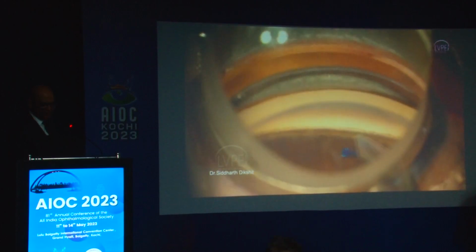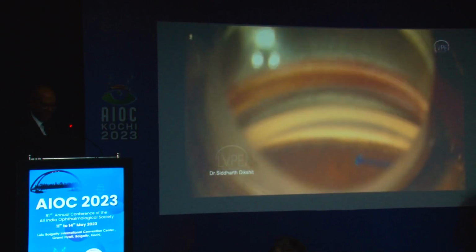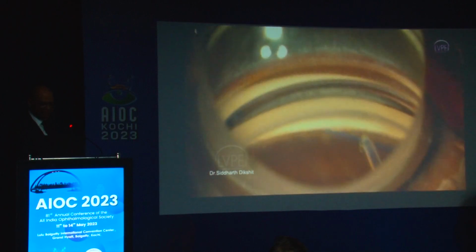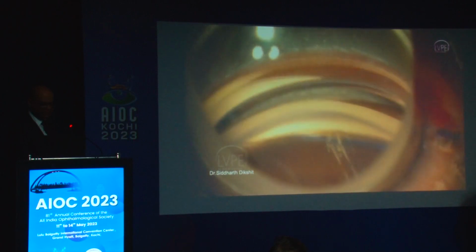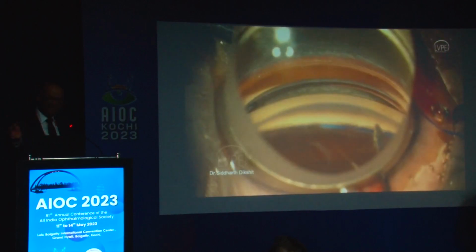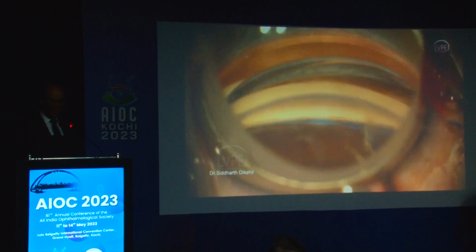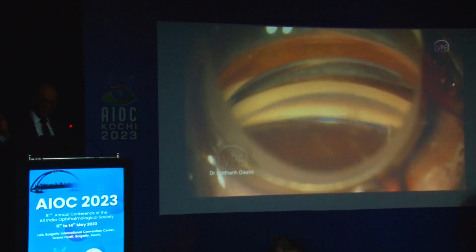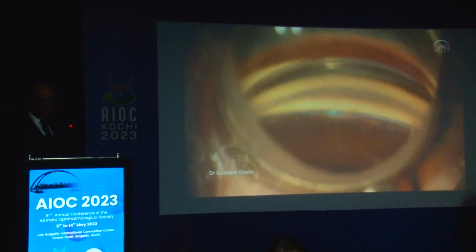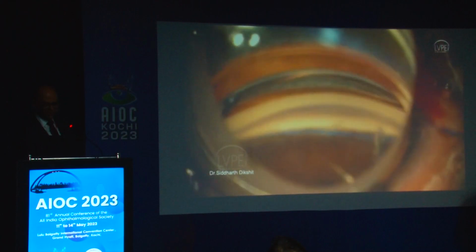And I'm incising the top of the trabecular meshwork with this MVR blade. And once that cleft is created, what you can see is me pushing the suture in. And when you push the suture in, you always have to remember that you go towards the angle first and then go forward. Towards the angle first and then go forward. This will give you the ability to push in almost 1 complete clock hour of the suture at one go. And within 12 to 15 strokes, you will have the suture coming through the other end.